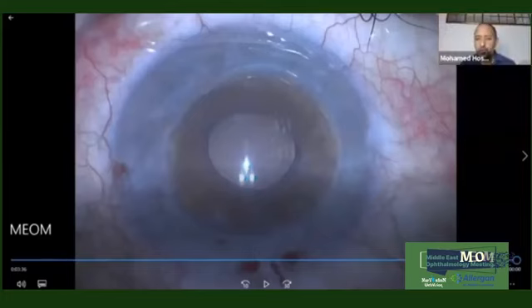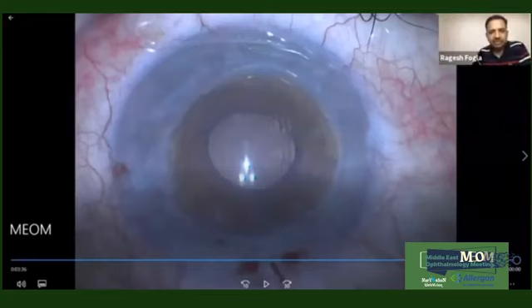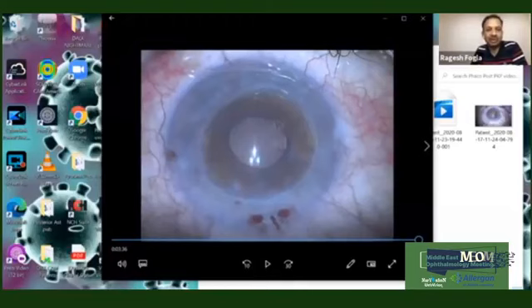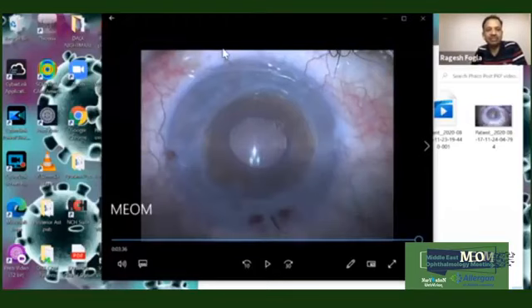Sometimes marking the cornea with all that's going on around the limbus is a little bit tricky. Sometimes you have difficulty because the graft and the pupil are not exactly in the center; it's slightly nasal, and then you have the graft. So you're not able to correlate the normal anatomy, because you get confused between the limbus and the graft-host junction. That is where sometimes you can have issues in trying to identify it.